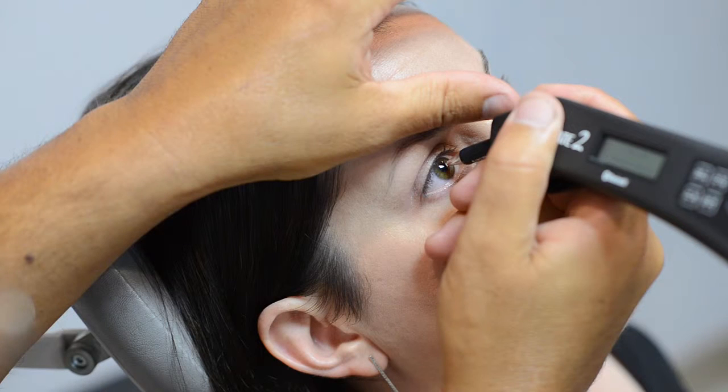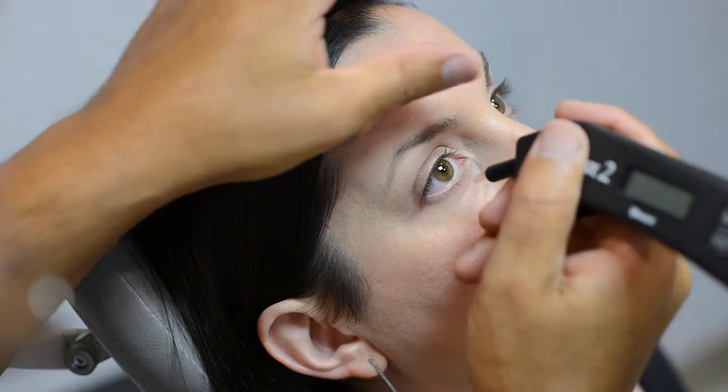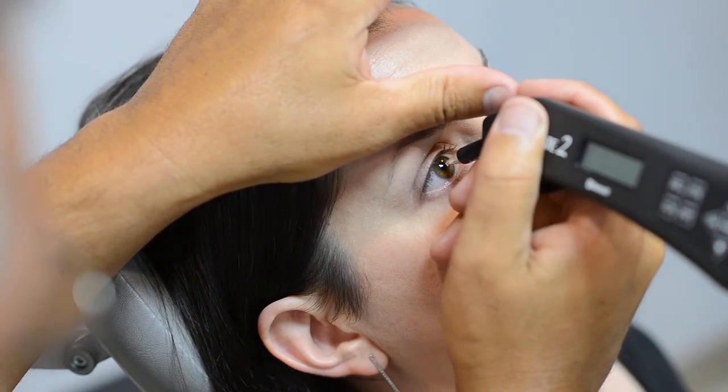If you maintain contact with the cornea for three seconds without proper alignment, you'll hear a long beep — your applanation is not correct. Again, disengage, adjust the probe, and gently try again.